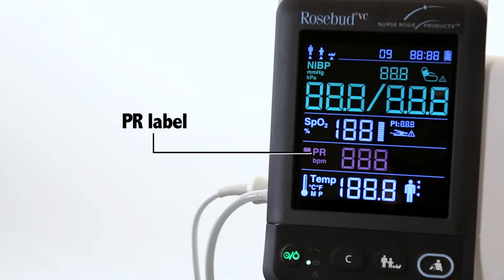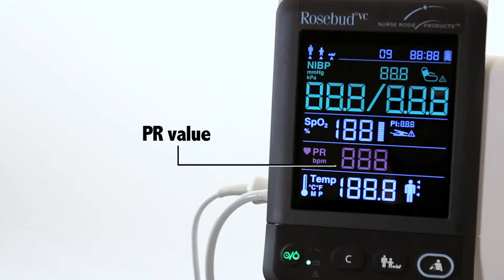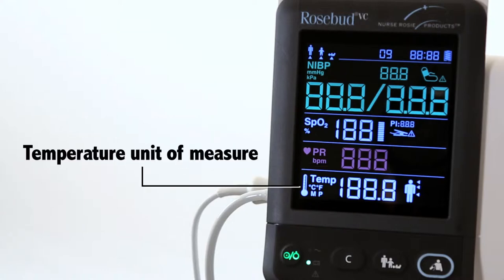The display also shows PR label, PR unit of measure, and PR value. Temperature unit of measure — Fahrenheit or Celsius — and measurement mode: M for monitor or P for predictive.